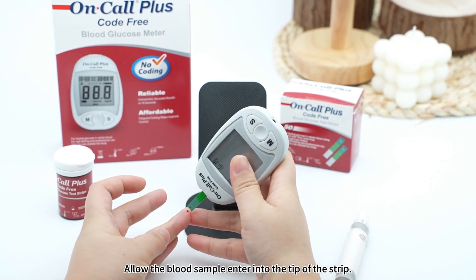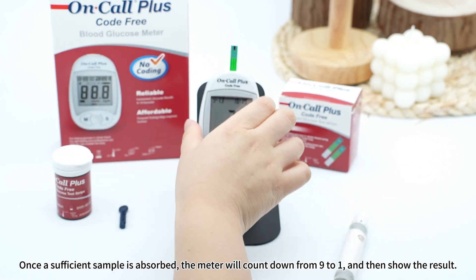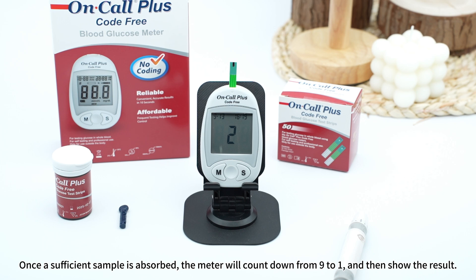Allow the blood sample to enter into the tip of the strip. Once a sufficient sample is absorbed, the meter will count down from 9 to 1 and then show the result.